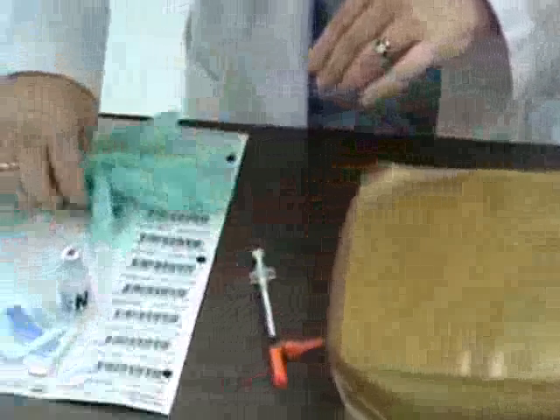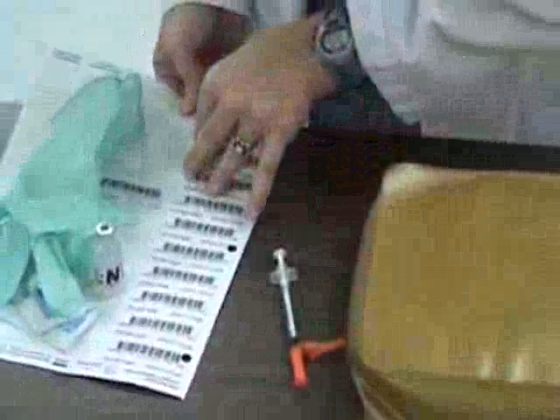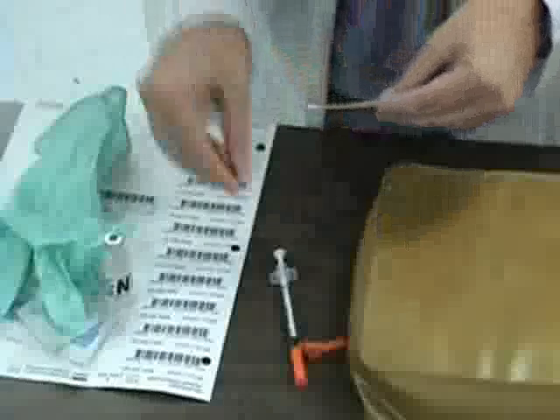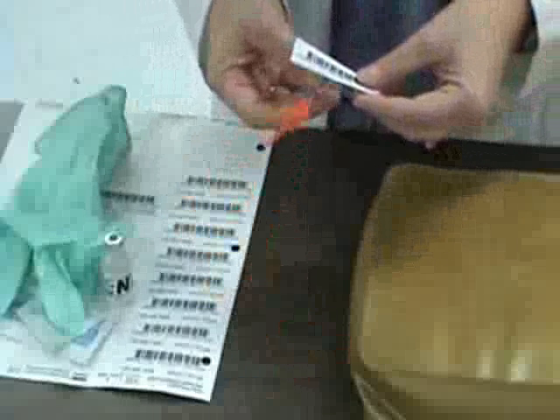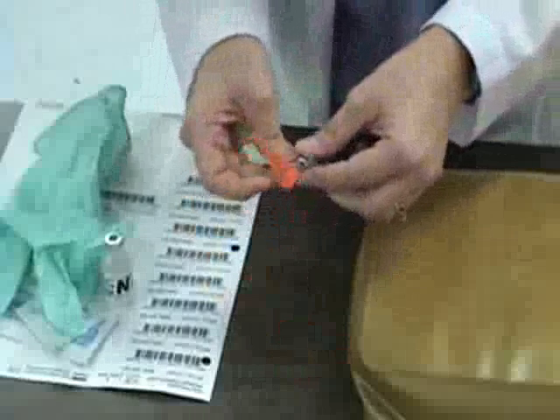The next thing that I'm going to do is label my medication. I need a patient label, and on the label I will write the medication, the route, and the amount. I will place this label on the syringe itself.